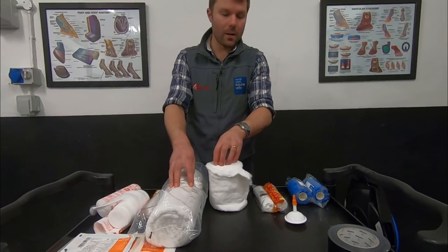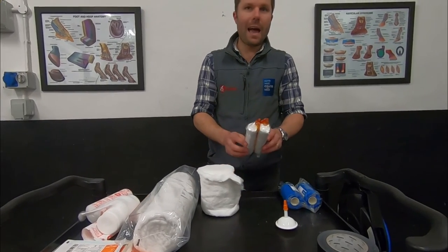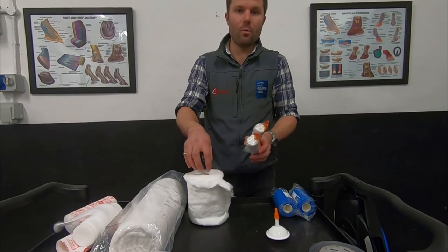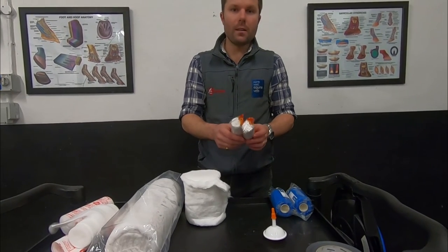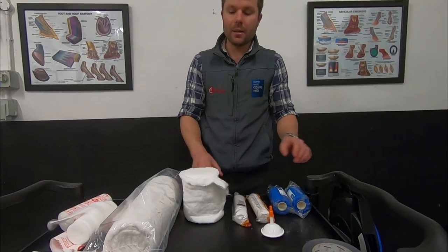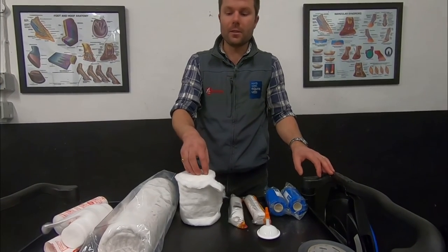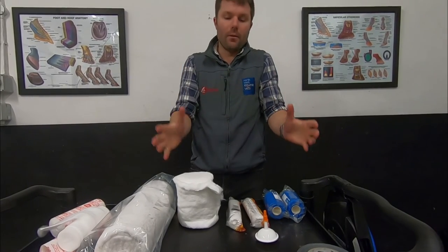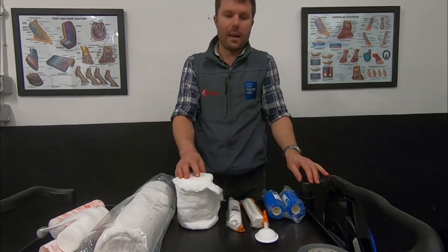Having applied our cotton wool, we then put on another layer of elastic dressing to keep that tight. At this stage, depending on how many layers of cotton wool we've added, we can begin to wind our tension in a bit harder. If you're looking at a horse with a suspected fracture, use lots of layers and lots of tension — but because you've got the cotton wool, that pressure is spread out over the whole leg and won't pull tight in any one place.